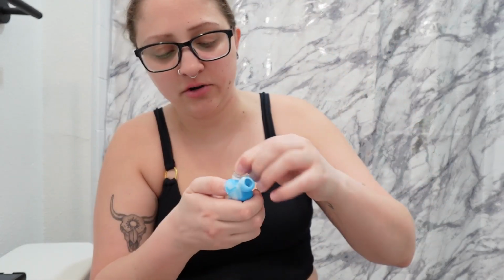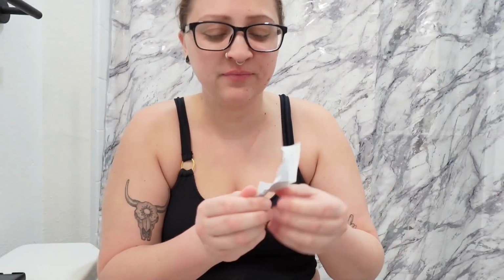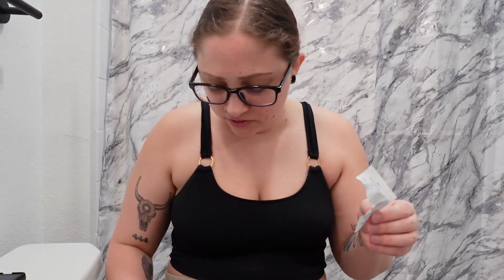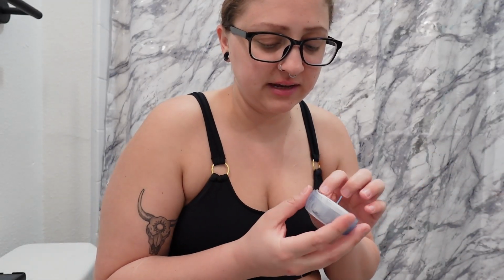We're gonna go ahead and take our new vial, put it in a vial protector. That way I know which one's opened, which one's ready to go. And if I take it out and it lands on a hard surface, I'm okay because I have a vial protector. I'm gonna take another alcohol swab, and I'm gonna do my leg again, just because I feel like my leg is just the perfect spot right now for what I want to do, which is run around, tan, whatever. I'm fine with it being on my thigh versus anything else.